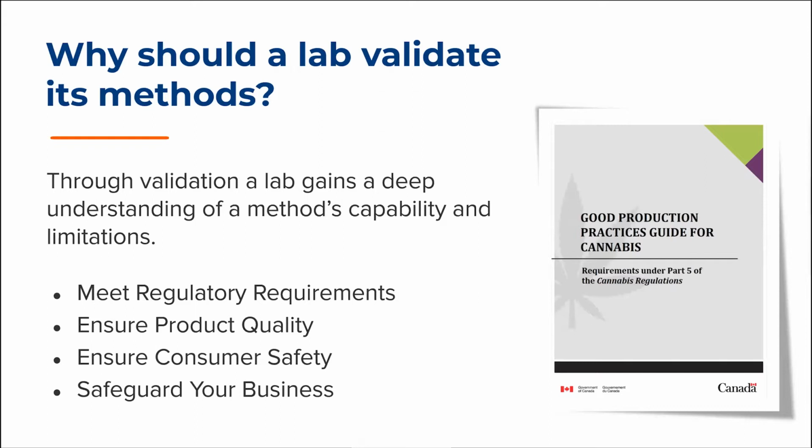First, through validation, a laboratory will gain a deep understanding of a method's capability and limitations. This understanding is critical to ensuring that when a method is used to assess product quality, the results are reliable, accurate, and true. The experience the laboratory gains with the method during validation will also lead to a better ability to predict how the method will perform when running new matrices and new samples.